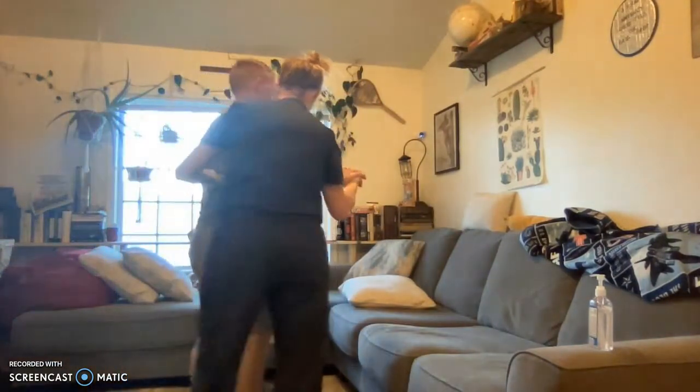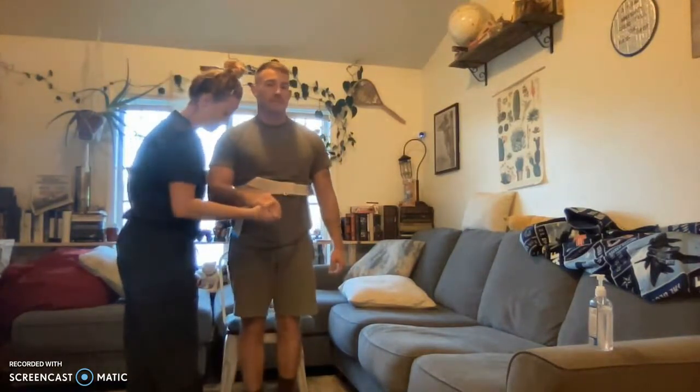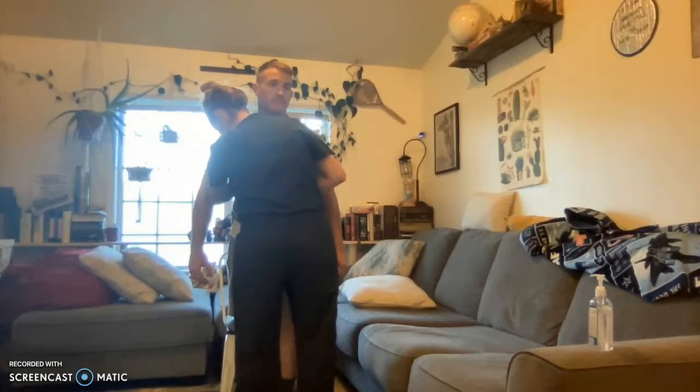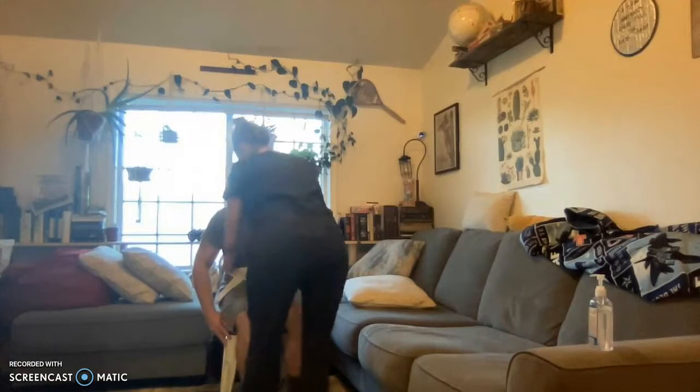All right. Before you sit, make sure you can feel the chair in the back of your legs. Can you feel the chair in the back of your legs? Yep. All right. Now slowly lean forward as I come brace your knees, okay? All right, go ahead and sit. There you go. Very good.